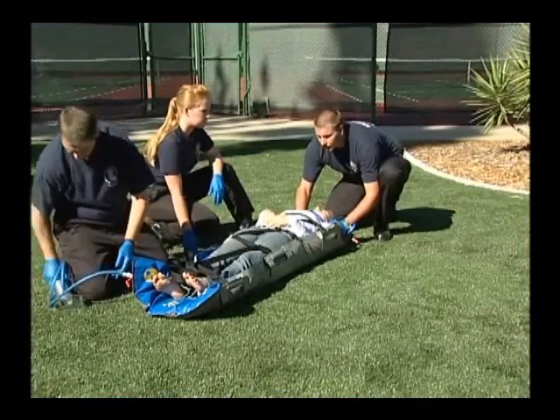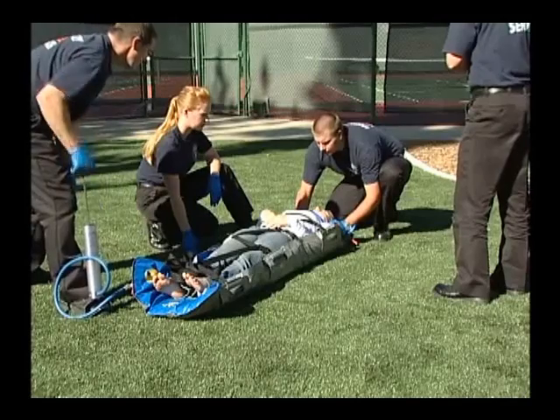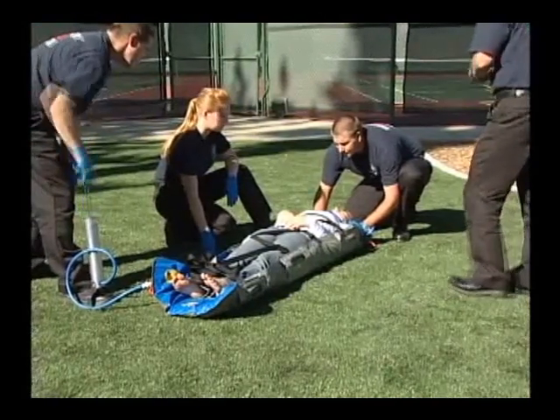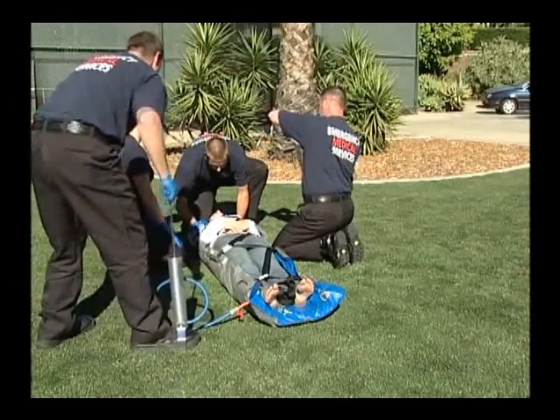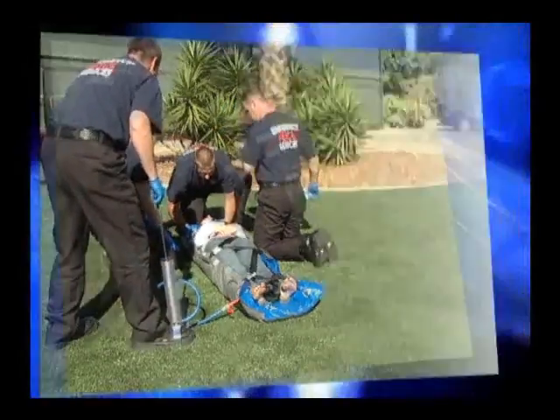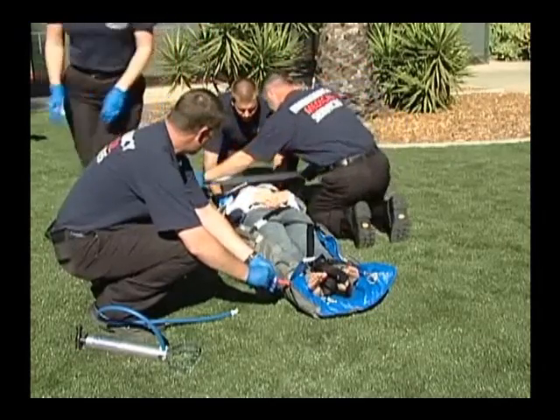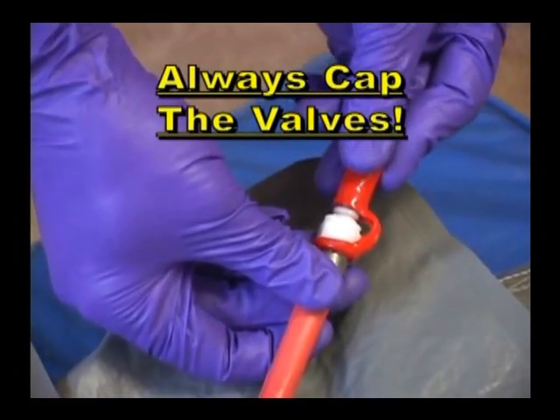Evacuate the air from the mattress using the valve located at the foot end. The head end valve can be used, or both valves can be used simultaneously, but it is preferred and recommended to use the foot end valve. Evacuate the vacuum mattress until the desired firmness is achieved. When using the evacuosplint mattress at high altitudes, more pump strokes may be required to achieve the desired firmness. To prevent accidental valve opening whenever a patient is being moved or when the mattress is being put away, always place the red leashed cap over the end of the maxi-valve.